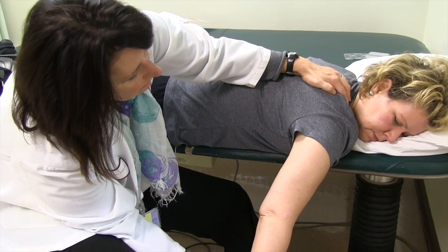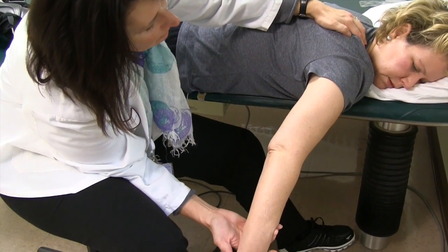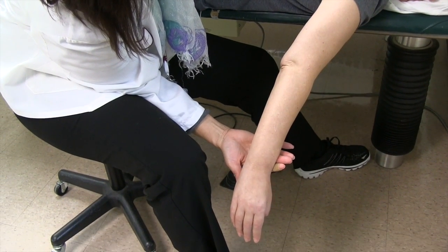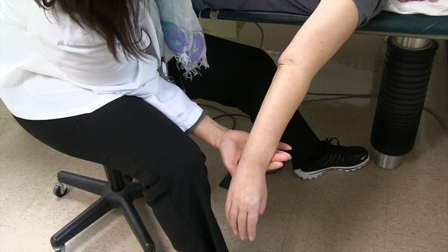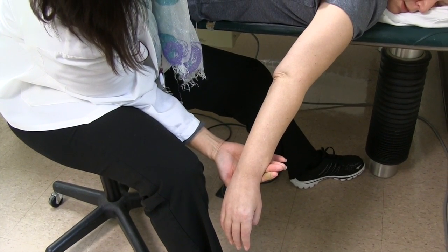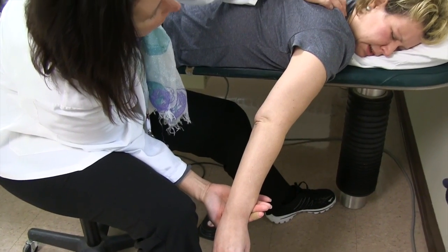Keep reaching — reach, reach, reach, reach. Shoulders okay? Pain at all? No. Stretch in the front? Stretch in the whole front of my arm, from my elbow down to my pinky. But not a painful stretch.